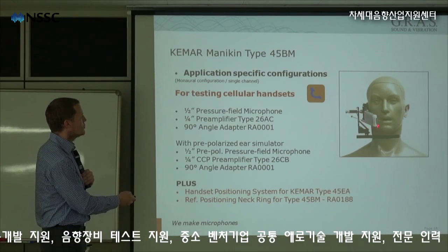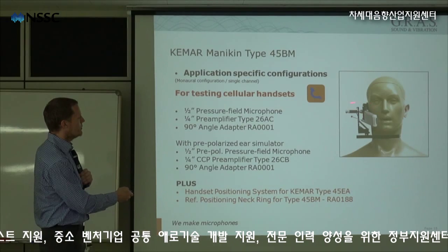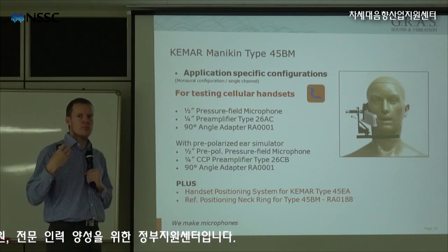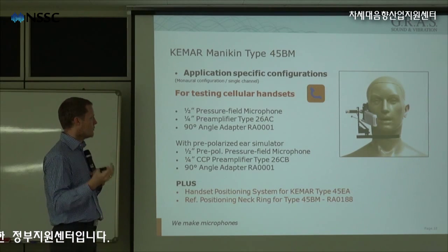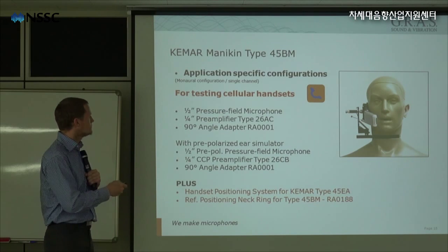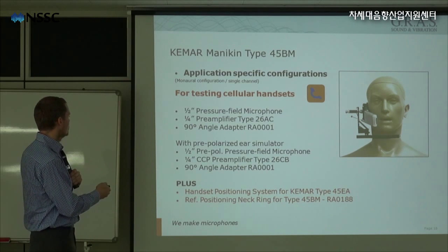The size of the holder is very small, so it has a minimum of influence on the sound field. And this makes it very attractive for doing telephone tests.